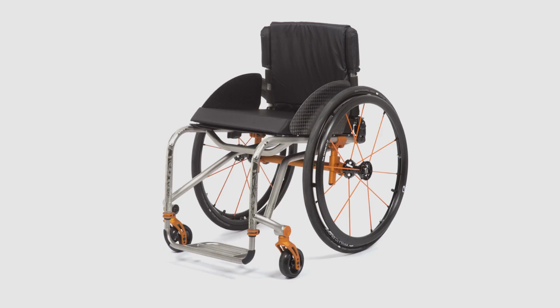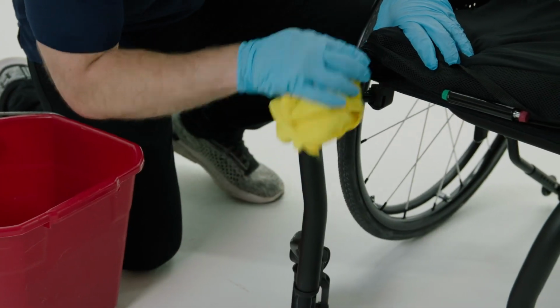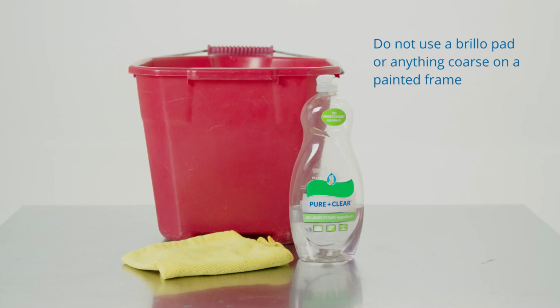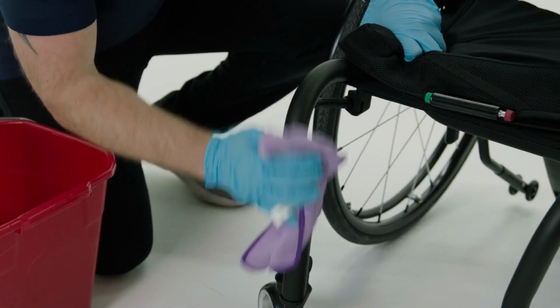Next, let's take a look at what you can do to clean your Tilite manual wheelchair. To clean titanium polished or satin frames, use a soft cloth to clean the finish. If necessary, moisten the cloth with glass cleaner. If cleaning a painted frame, use a soft clean cloth with soap and water to clean the frame. Immediately dry all components and parts that become wet.